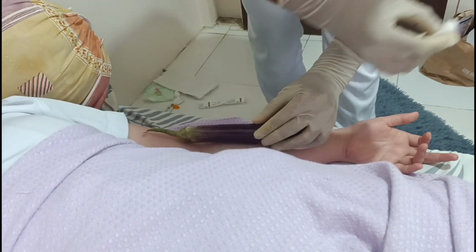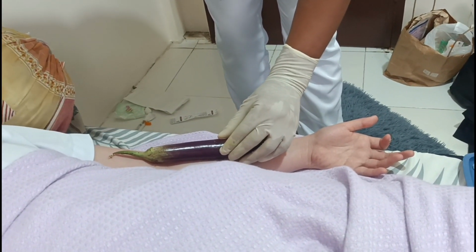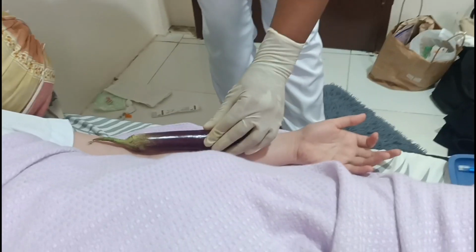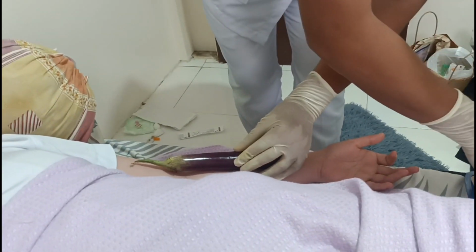Now encircle the bleb with a blue or black ball pen and instruct the patient not to rub the wheal or erase the mark. Please do not rub the mark, ma'am. Red pen may influence the reading and massaging the area may interfere with the test results and spread the medication to the subcutaneous tissue.